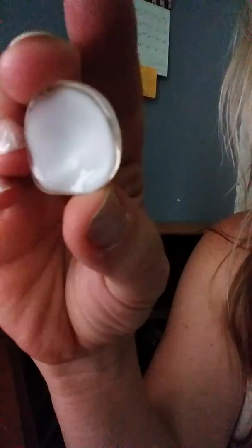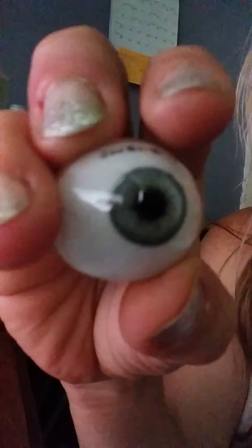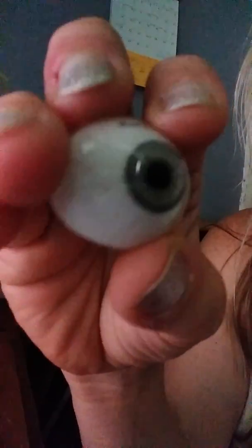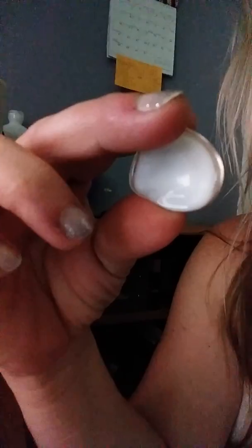Now the backside of this — people think it's a round ball, but it is not. It's literally like a cup. It suctions to your eye socket because the only thing holding this in is your eyelids and then the suction — the round part right here — the suction that goes to your eye socket. This is what a real prosthetic eye looks like.